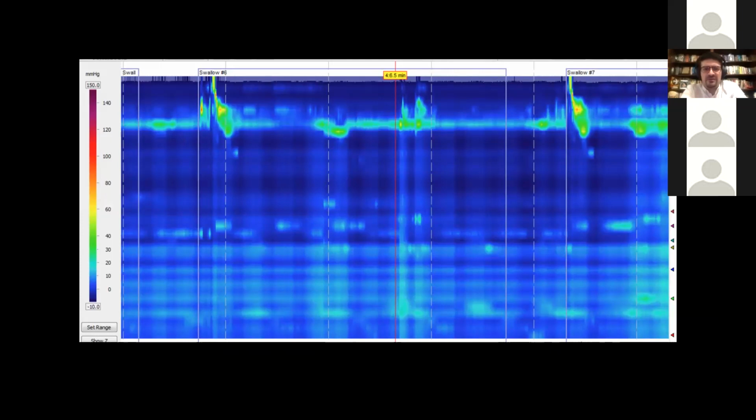Sometimes you'll see this, and as radiologists say, clinical correlation is required. A bunch of times in manometry, you will have to correlate with patient symptoms and other diagnostic studies like upper GI and EGD. But if you see this in a patient with dysphagia, most likely it's achalasia type 1, even though you couldn't really get a good sense of the LES here.